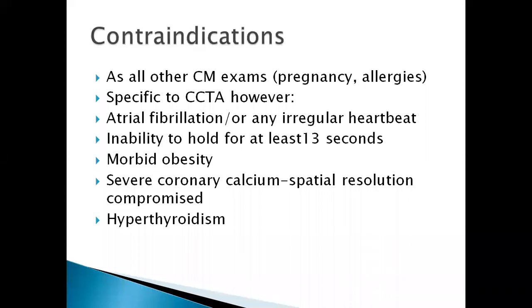But this is not just done within the department. The moment we find out the patient is allergic, we call the referring doctor, and then we discuss with him. And if he says that he's going to cancel the examination, then well, we have to honor that. But most of the times we pre-medicate, and then the following day we go ahead and do the examination.